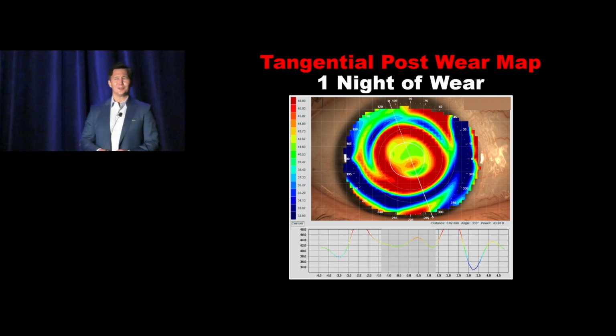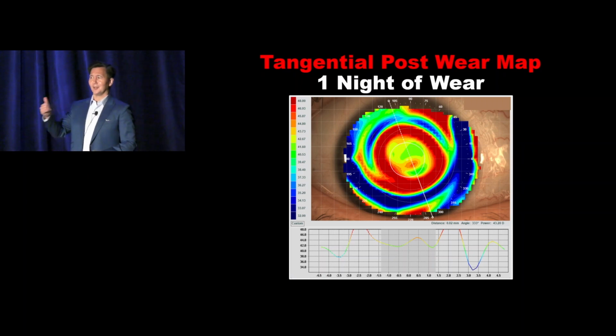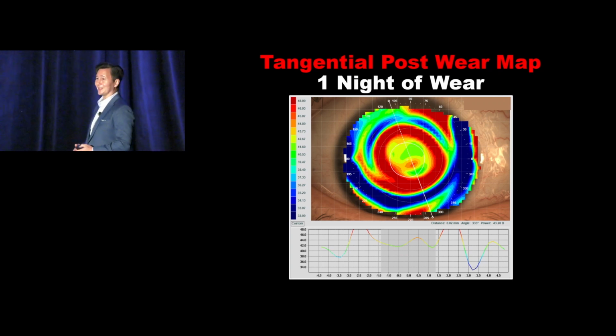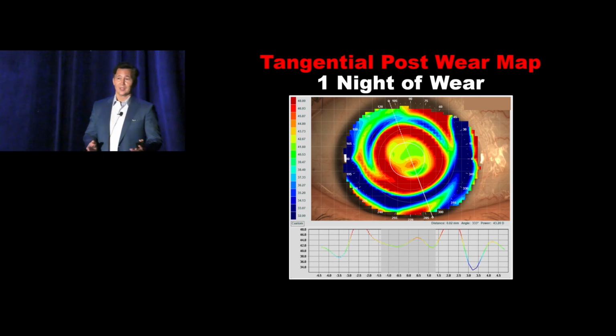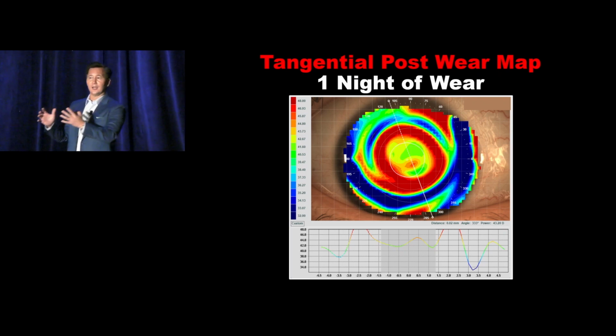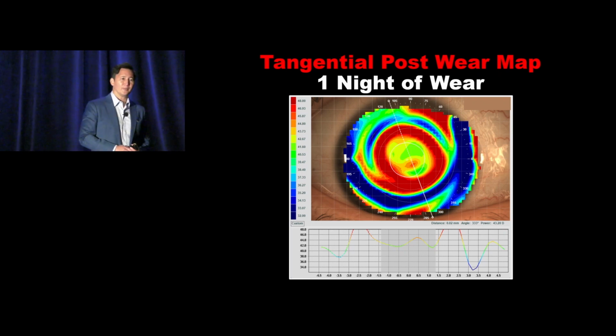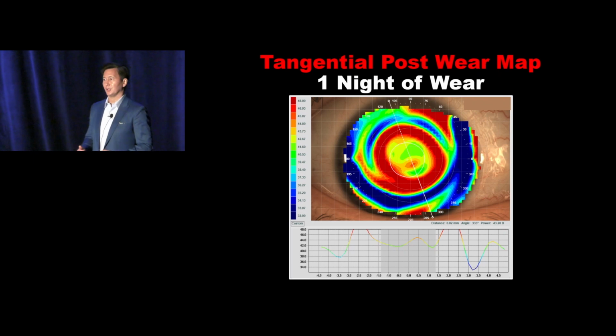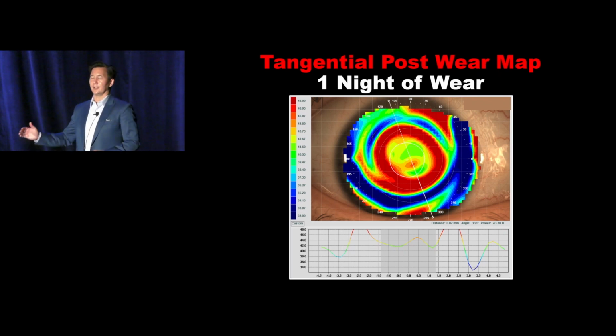So I don't know about you guys, but I've seen some suggestion that maybe there's a bullseye beginning to form, that it could be central island, it could be smiley face. You know, all of these things very opposite to each other. So here's the story. Don't sweat one night. If you think that the eye is happy enough, that there aren't any signs that would suggest you've got to pull this patient out of wear, just let it go.